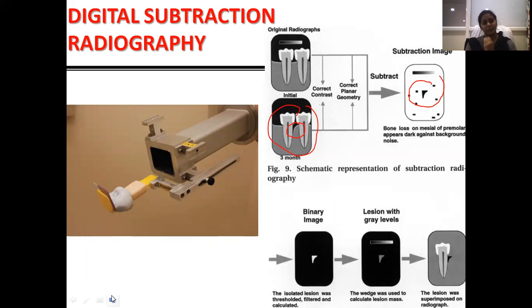We are taking a lot of effort, not only in the case of cost. We are putting a lot of effort in taking all these serial images. We are saving, we are preserving all these bitewing blocks. But even if it detects minute amounts, what is the use? We are not able to appreciate that clinically, right? So that was what Moll stated.